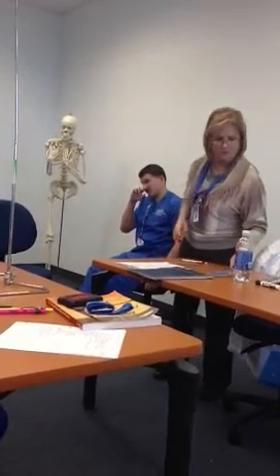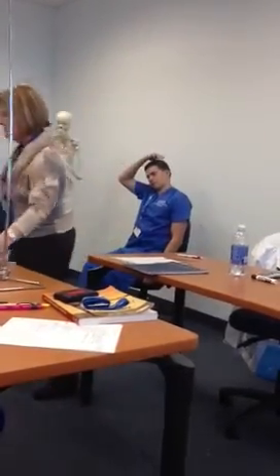Now, who had one of the small goniometers? They're missing one.